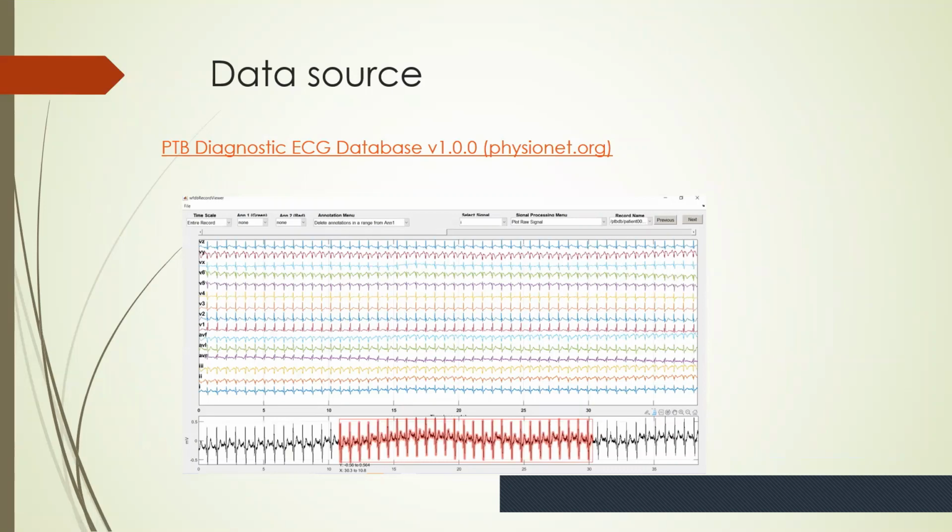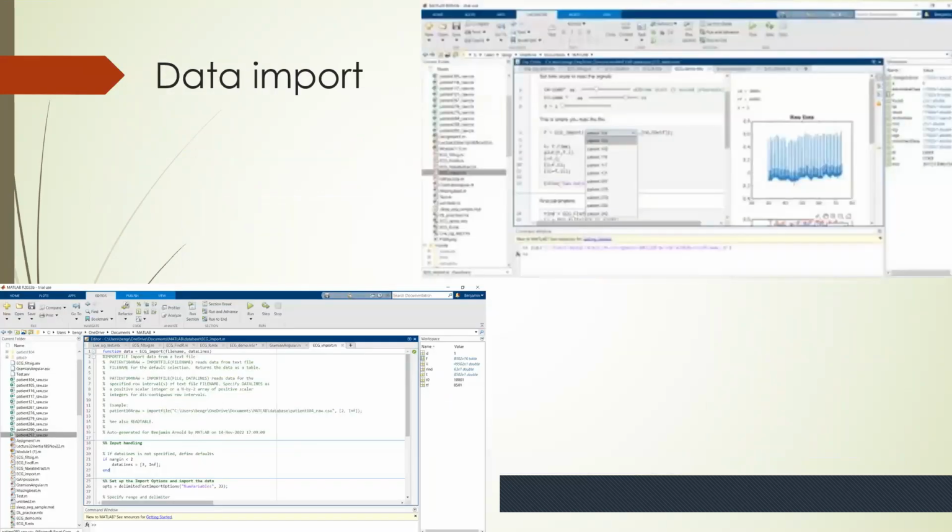To do this, we used sample data from the PTB diagnostic database. We imported this using the WFDB record viewer. This was then passed through a pipeline of functions to access it with code.